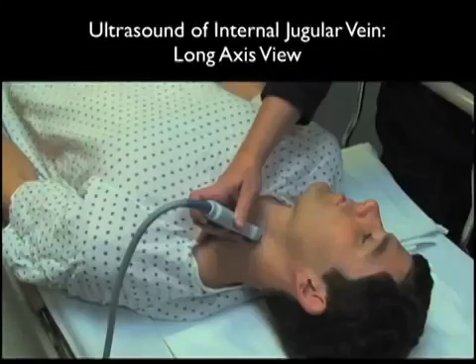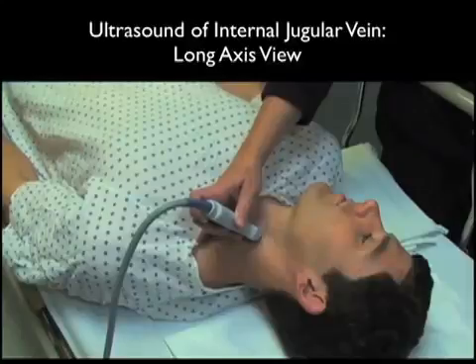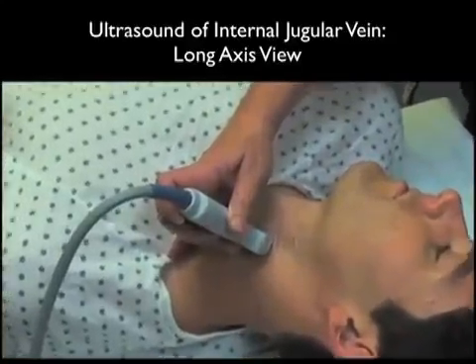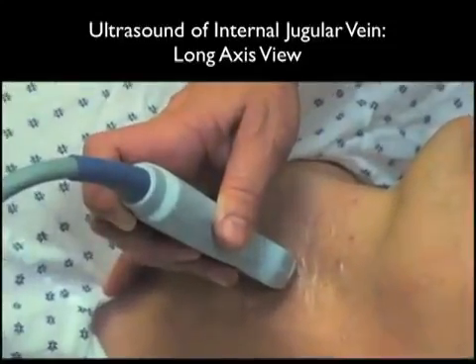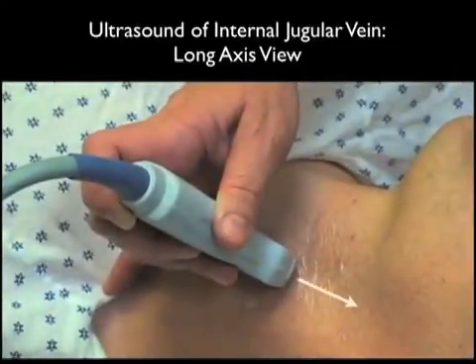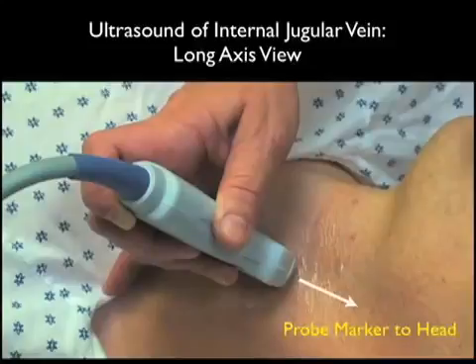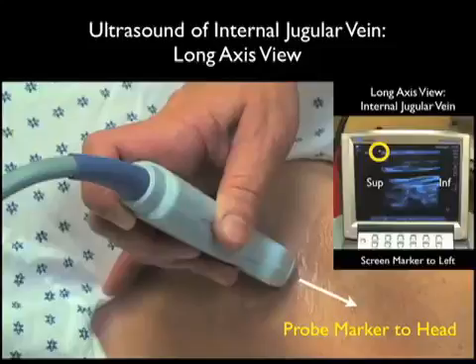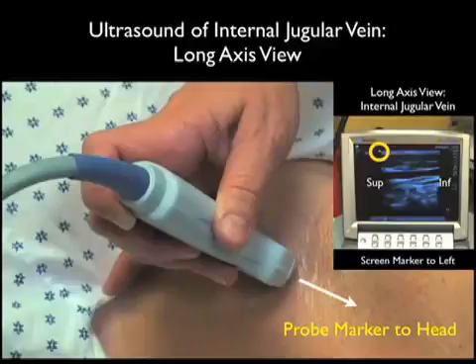Here's the high-frequency probe placed in a longitudinal or long-axis manner on the patient's neck. Notice here that it's running along the course of the internal jugular vein as it runs up and down the patient's neck. By convention, I like to have the probe marker towards the patient's head. Therefore, I know where it lines up on the ultrasound screen. Notice here, as the screen indicator dot is towards the left, that superior on the internal jugular vein will be located towards the left of the screen, and inferior will be located towards the right of the screen.